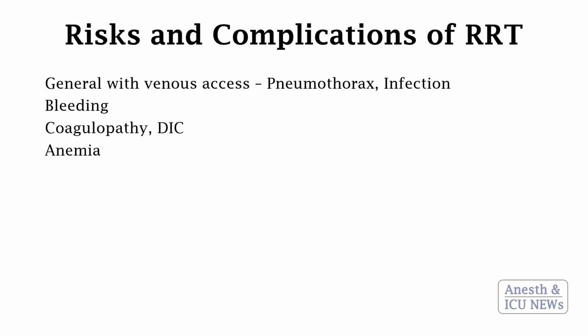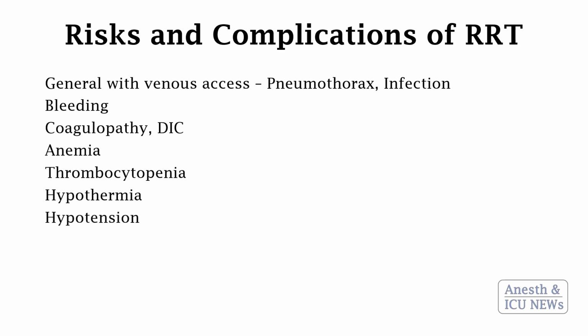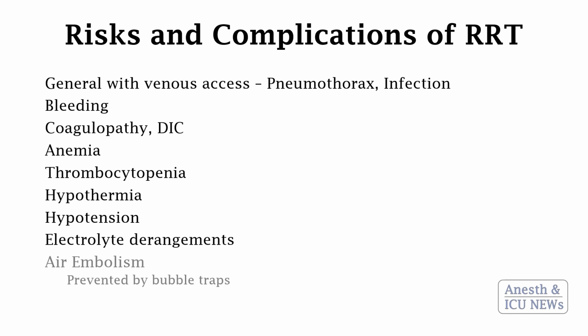Anemia can be intensified due to initial dilution, bleeding, or loss of the extracorporeal blood by clotting of the circuit. Note this advanced knowledge that convective methods cause somewhat more damage to the platelets. As renal replacement therapy cools down the patients, hypothermia can obviously occur. And on the other hand, fever doesn't have to appear in patients because they are simply cooled. Hypotension can be due to hypovolemia, for example.